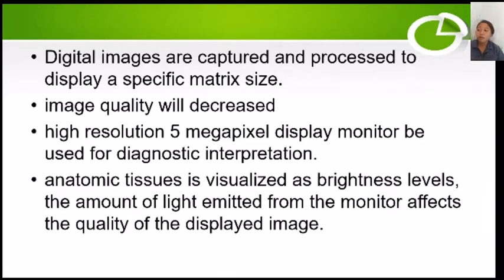Therefore, the monitor matrix size should be at least as large as the image matrix size. And it is recommended that a high-resolution 5-megapixel display monitor be used for diagnostic interpretation. It is because anatomic tissue is visualized as brightness levels, and the amount of light emitted from the monitor affects the quality of the displayed image.